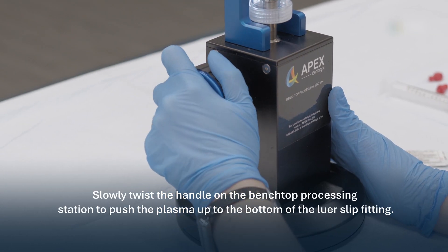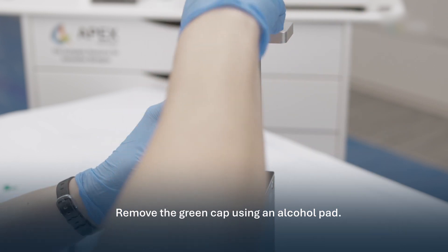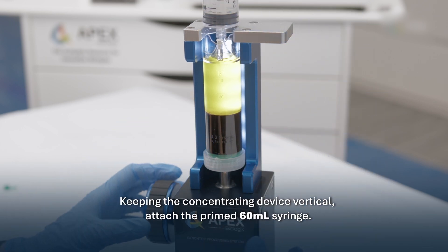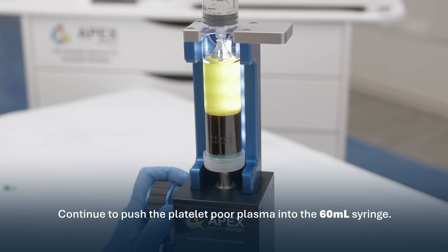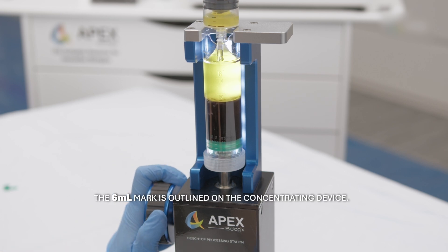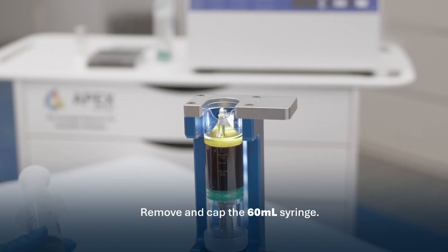Slowly twist the handle on the benchtop processing station to push the plasma up to the bottom of the luer slip fitting. Remove the green cap using an alcohol pad. Keeping the concentrating device vertical, attach the primed 60 milliliter syringe. Continue to push the platelet-poor plasma into the 60 milliliter syringe. The 6 milliliter mark is outlined on the concentrating device. Remove and cap the 60 milliliter syringe.